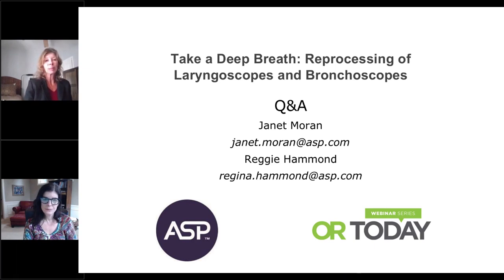So there are some options out there for everyone, and I just want you to think about the scientific evidence behind drying those scopes. It's not something to ignore, and it is a very important part of scope reprocessing.